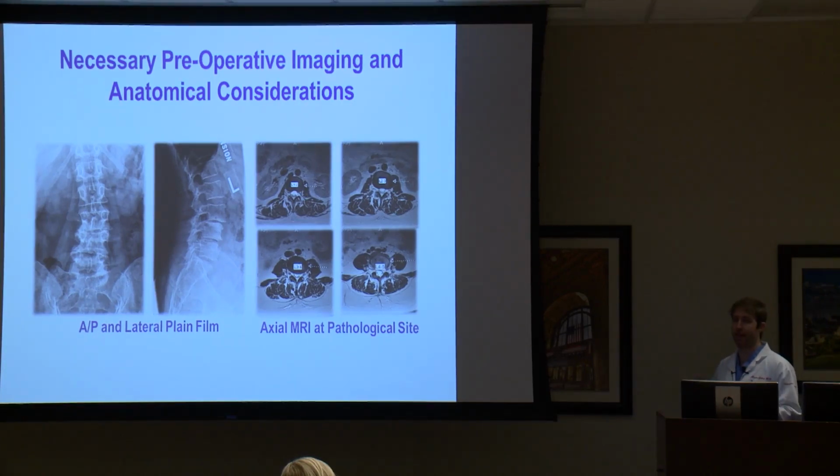And in order to tell that, usually someone will have a CT scanogram of some kind or an MRI of some kind, where they have that scan of your whole body on the outside, and you just measure to get a gross idea of how it's going to be. Now, some of that stuff sloughs away when they're on their side, so it's not a perfect picture, but 19 is as big as it goes.